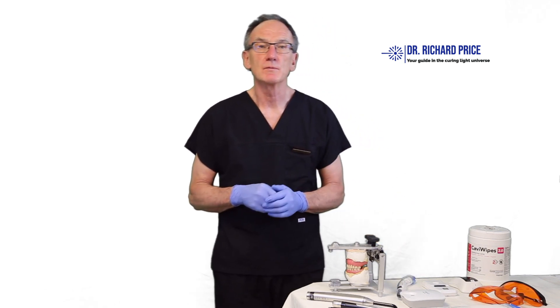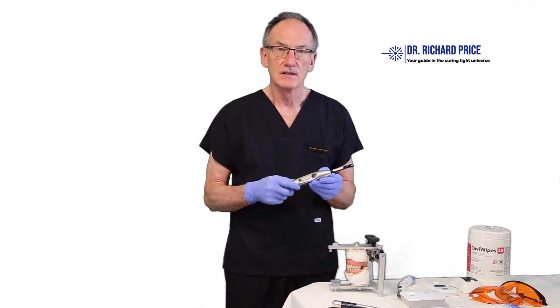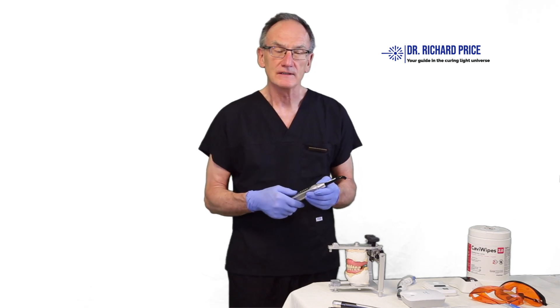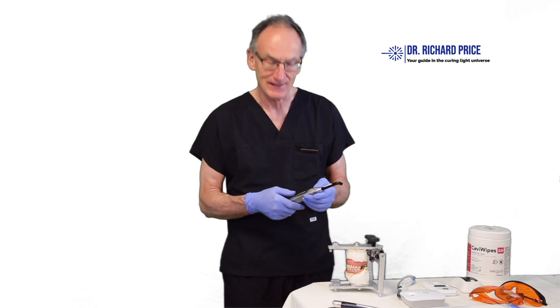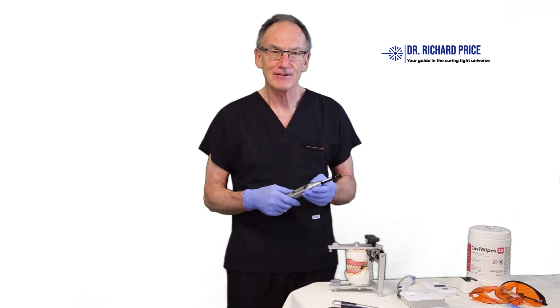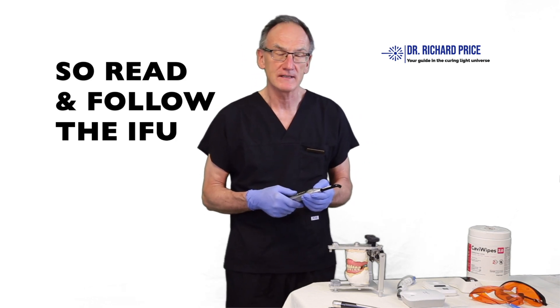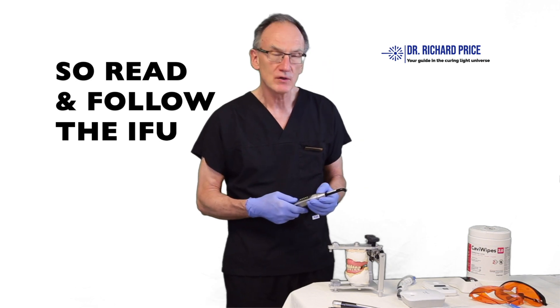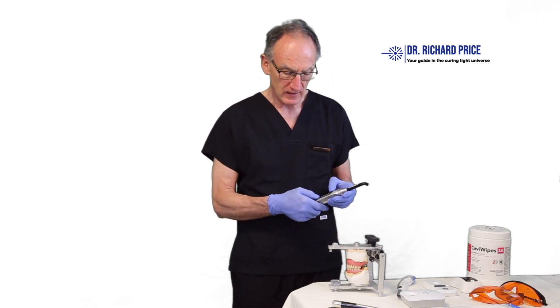The next thing to do before light curing is to set the curing light to the correct exposure time. Some people cure every restoration for the same amount of time — 10 or 20 seconds — but different composites actually require different amounts of light exposure. Some only require 10 seconds, some require 20 seconds. Make sure you read the instructions for use and set the curing light accordingly.